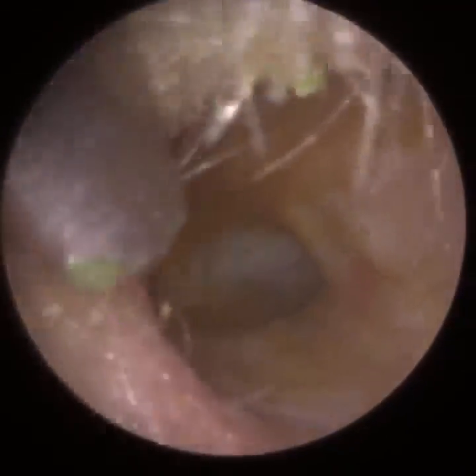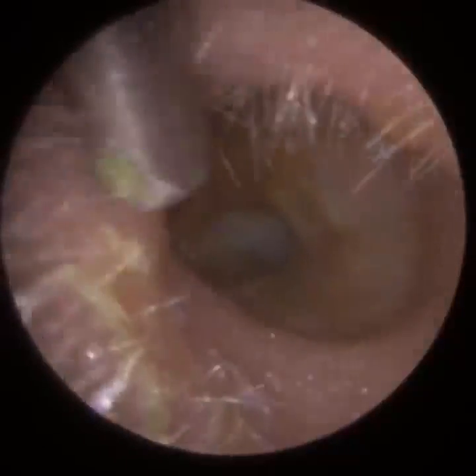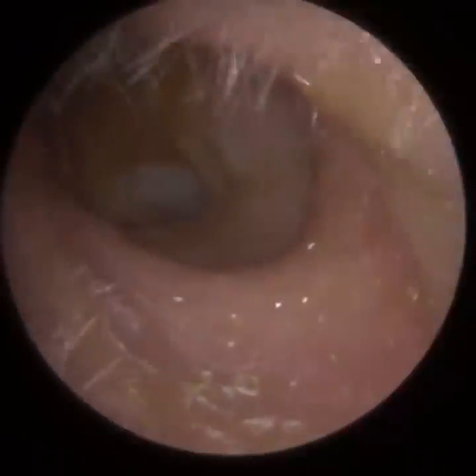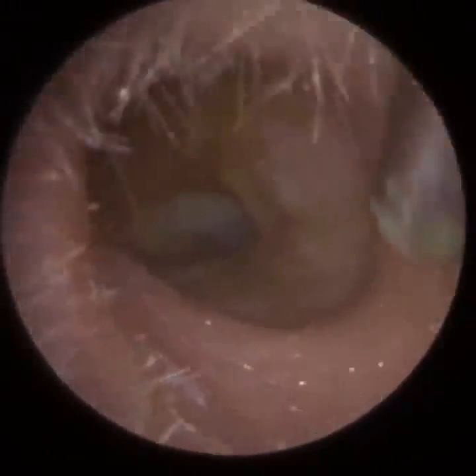So again, just near the entrance here, just some dry skin. I did put some drops in there, I had to because it's too crusty, it was blocking the tube as well, so just to loosen it. And obviously we suctioned all this, the dampness, out as well. And already it just looks so much better, so much clearer.